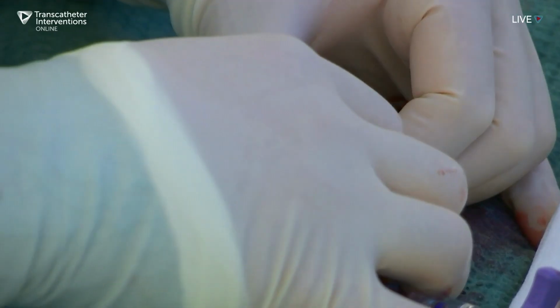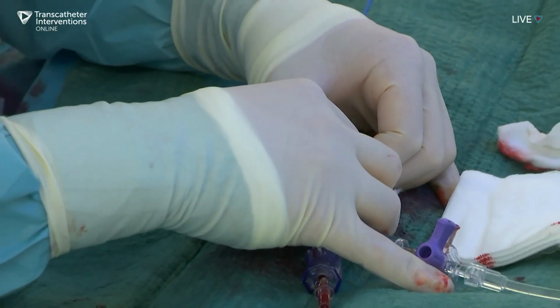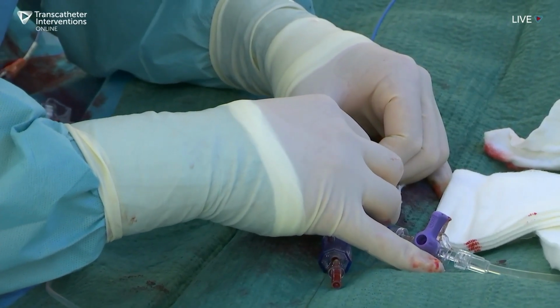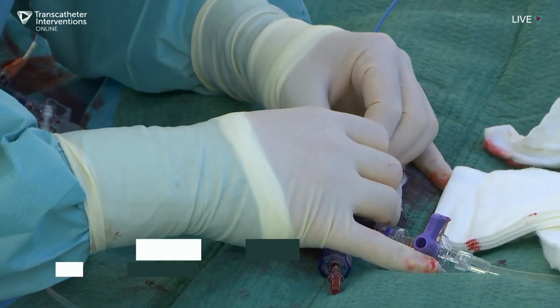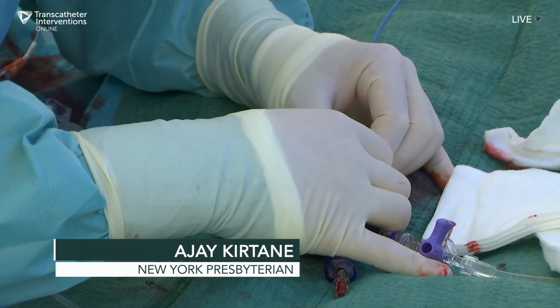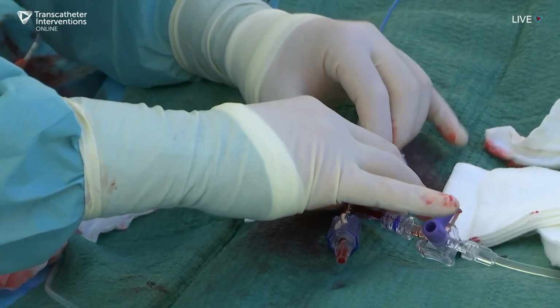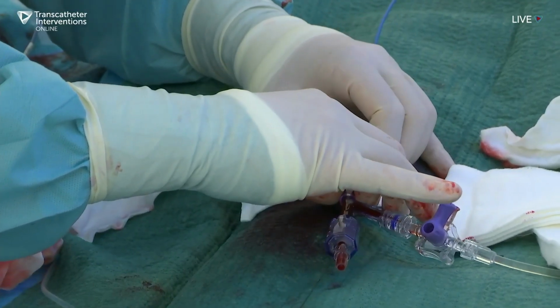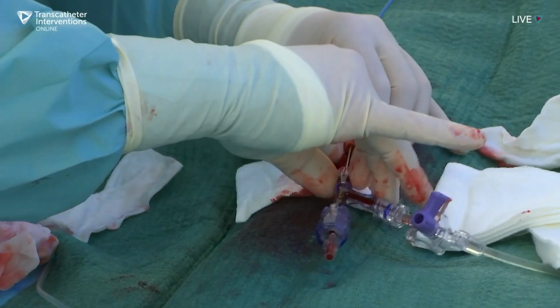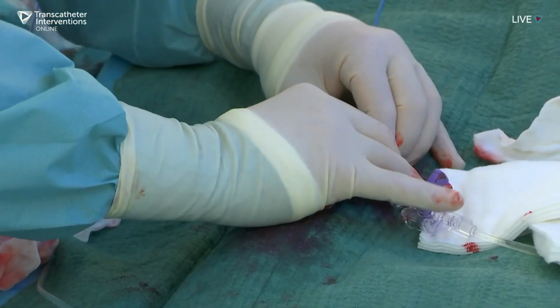Sure. Now, one of the reasons it's not bleeding so much is because he has the guide extension down into the right via the antegrade guide. Other times when you don't have a guide extension, you can sometimes put a Kelly clamp up more on the guide so that it doesn't bleed as much during this time period. But now you'll see the wire come out through the Y adapter, and then he has a nice rail to be able to do all the work he needs.